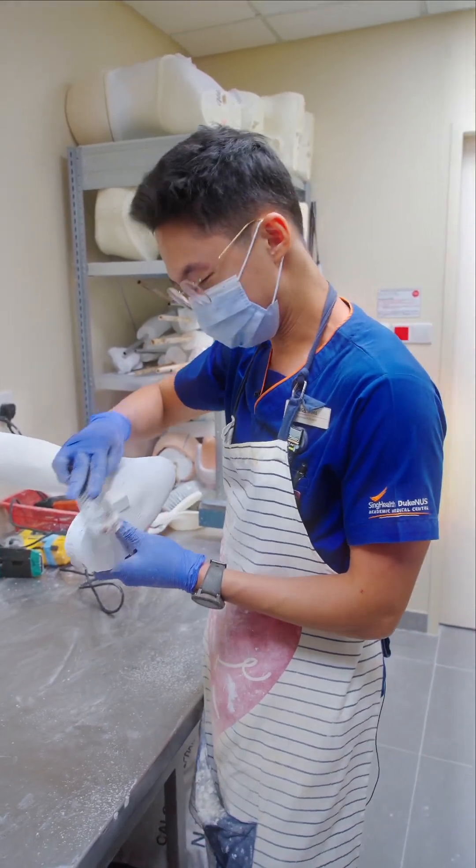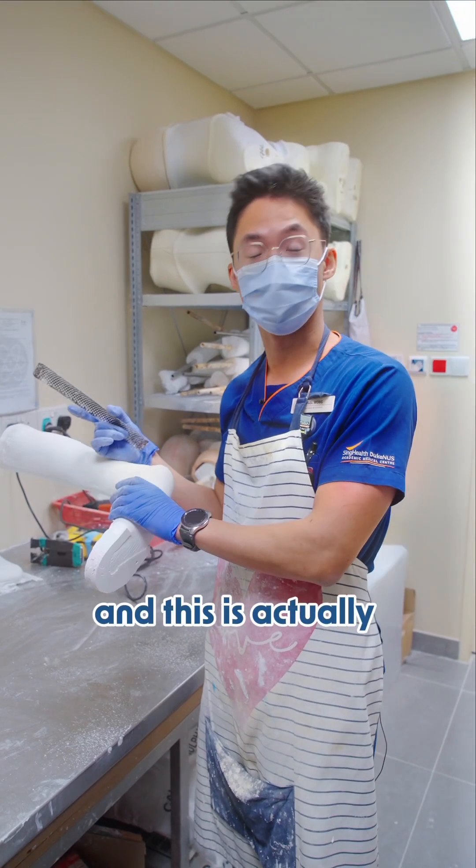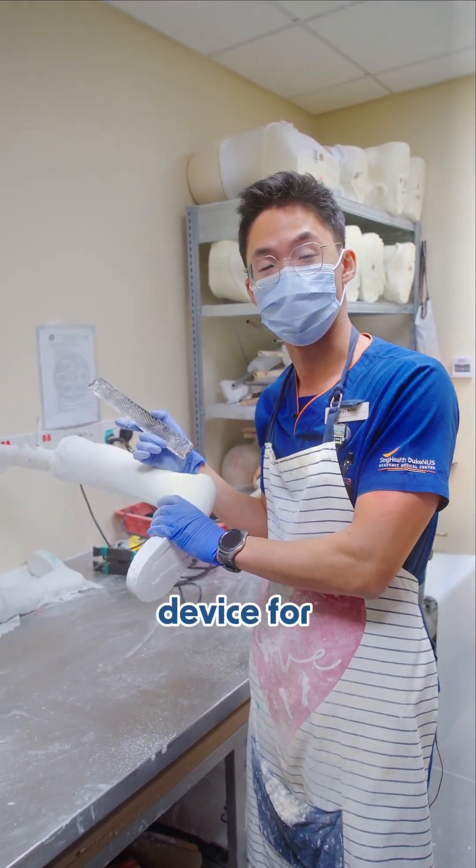Wow, looks like you're building a robot. A robot? No, I'm a prosthetist and orthotist. And this is actually an orthosis, which is an assistive device for my patient.